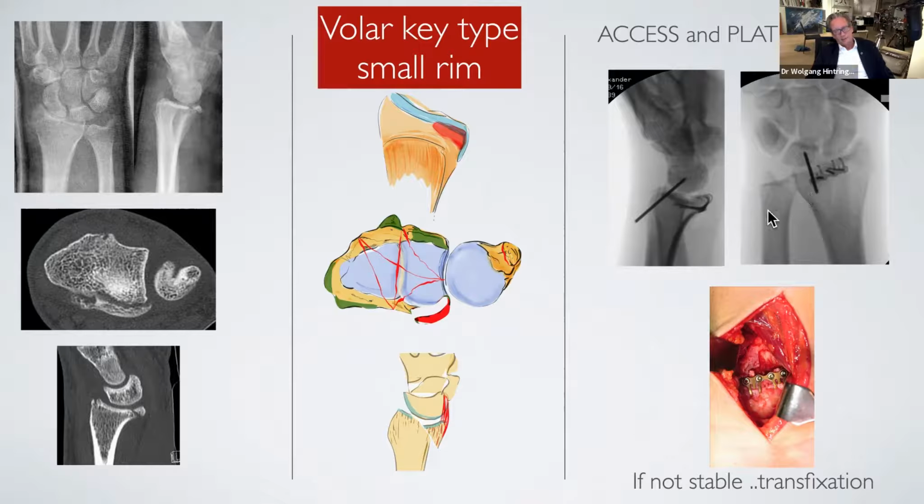more stable situation. Sometimes if the rim fracture goes also on the radial side, we also put in 2 K-wires because we then have a symmetrical dislocation to the volar side. Then we need here a K-wire and here a K-wire.